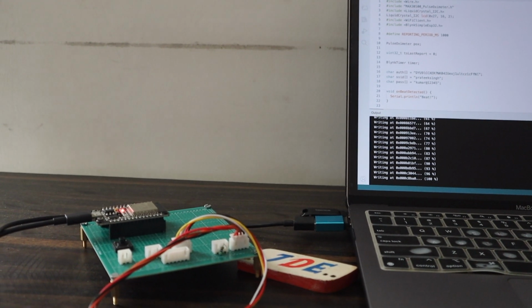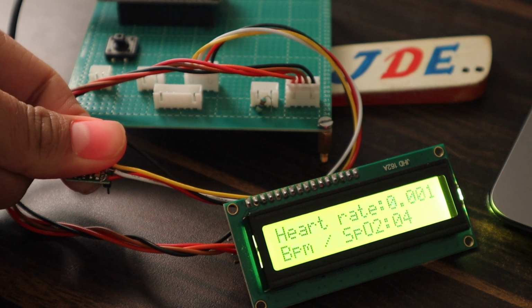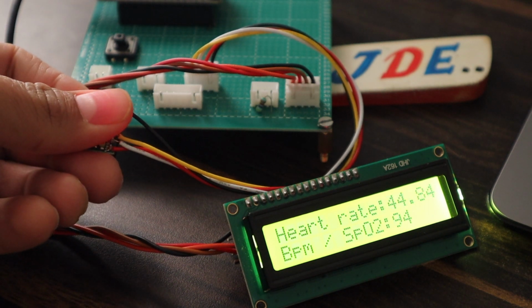Okay, now see the working of this project. When I put my hand near the touch of this MAX30100 sensor, it measures the proper heart rate and SpO2 level. See, heart rate is 44 and SpO2 level is 94.